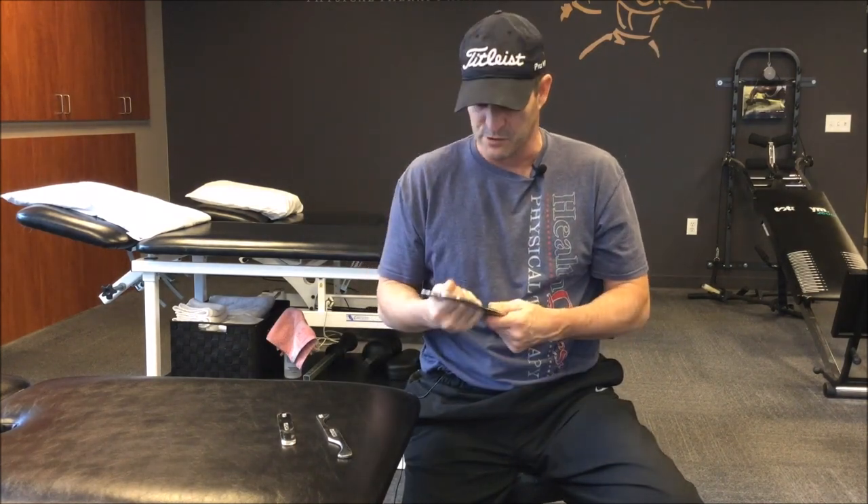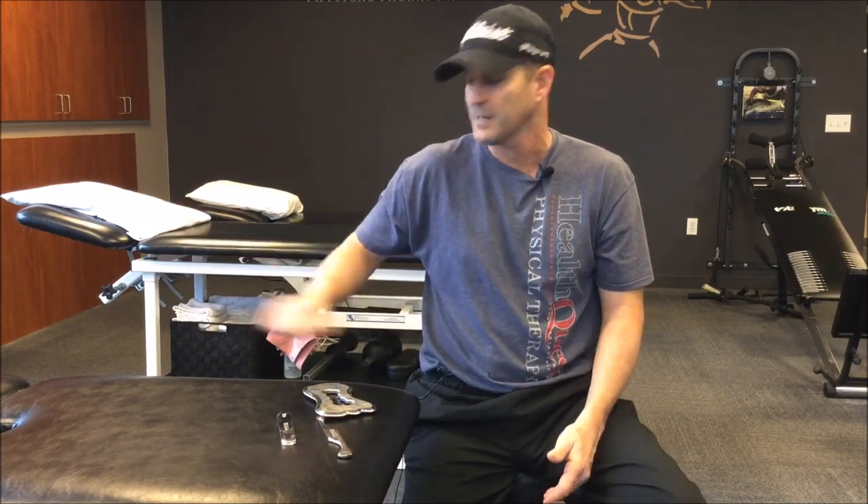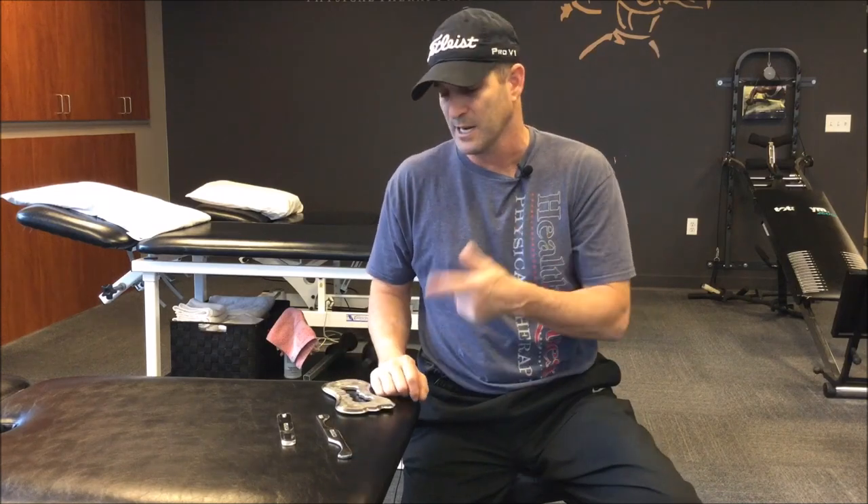There are some new tools that have come out — RockTape has their own. It's important to use the right edge, and it is always better to start more diffuse and then go to more specific. We did a video last week on a mobilization technique for a Tommy John scar, so make sure you check that out. What we're going to do today is use the Graston technique on a scar so you can see how to do it more effectively.